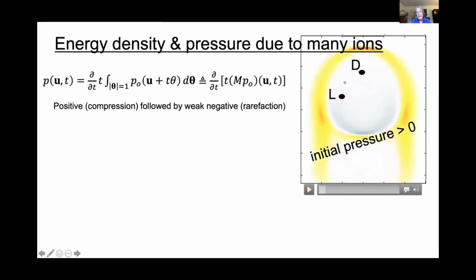Okay. But now I want to wind it back and make a point that we've been relying on experimentally so far. It's that if you place a transducer distal to the Bragg peak, distal to the treatment spot, you get a much sharper and stronger pulse than you would get if you placed it laterally. So in the experimental setups, we really try to put our receivers downstream, distal to the beam.